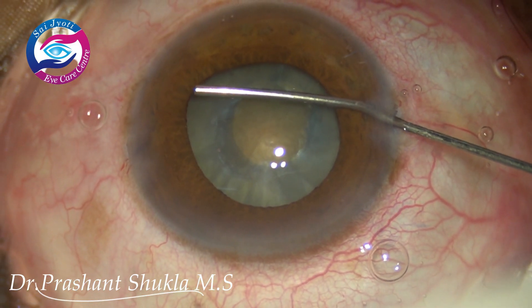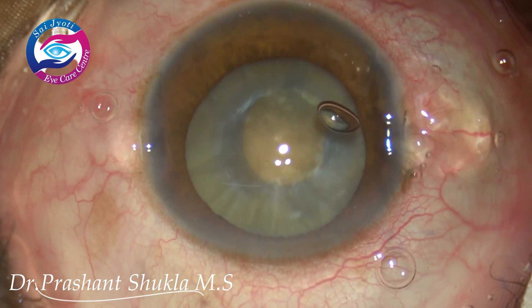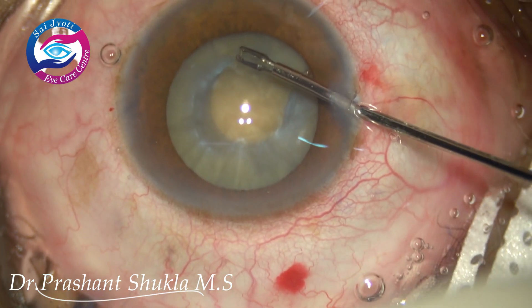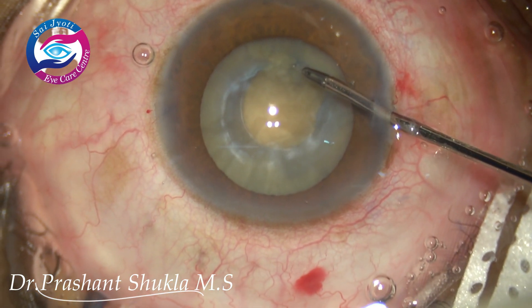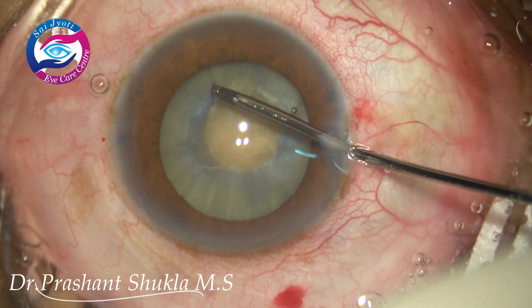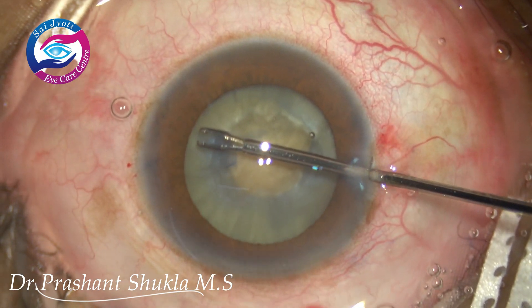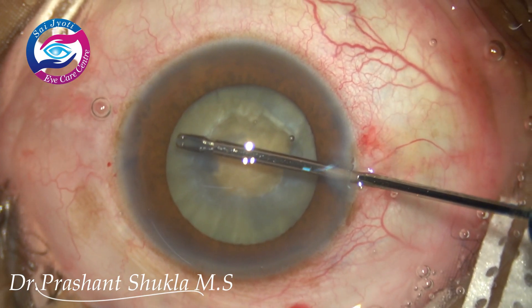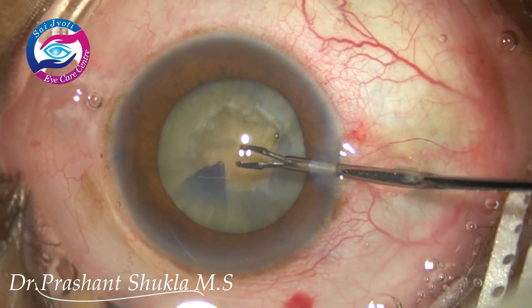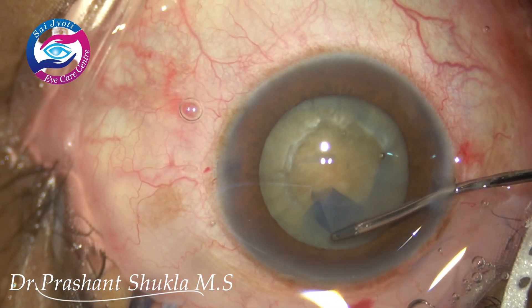After decompressing the bag, I am using the same viscoelastic again. Note the position of the cannula, which is directed away from the capsular margin, because we don't want the viscoelastic to go into the capsular bag. A small leak has been made using micro scissors, and now the secondary rhexis has been initiated.